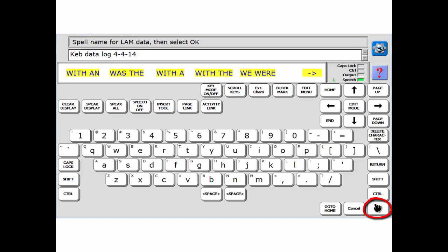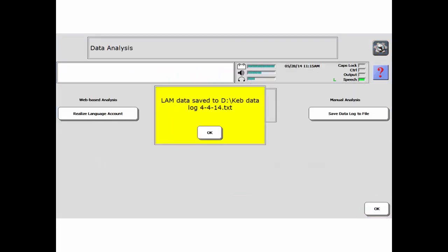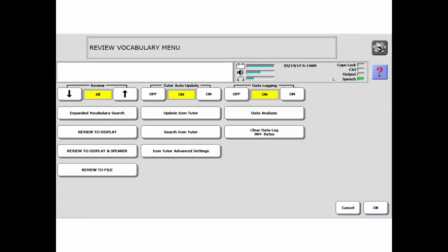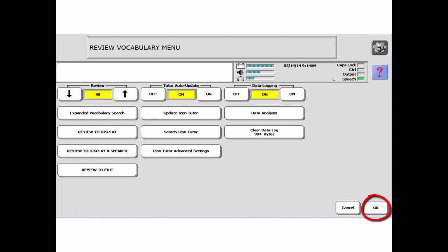Then select OK. A yellow box will appear when the file is saved. Select OK again. At this point, you can keep data logging on or turn it off. You can clear out the data log or keep adding to it. Select OK and then go to Home.